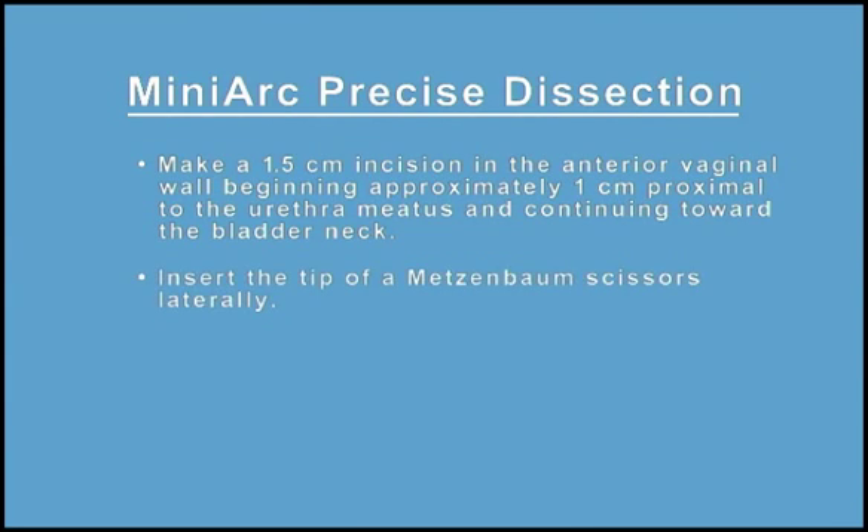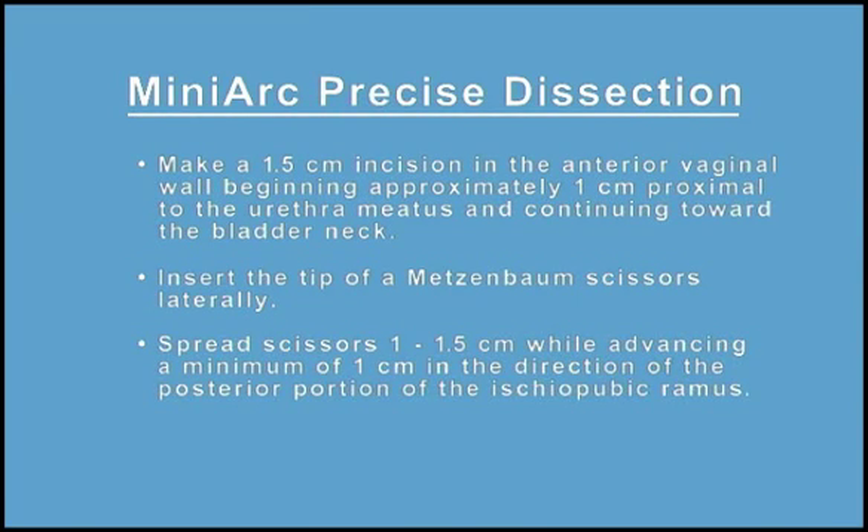Insert the tip of a Metzenbaum scissors laterally. Spread scissors 1 to 1.5 cm wide while advancing a minimum of 1 cm in the direction of the posterior portion of the ischiopubic ramus.